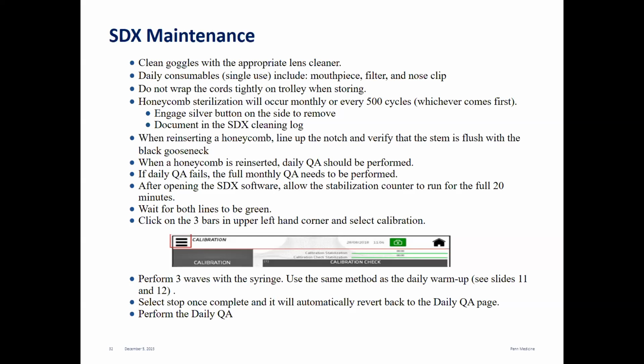So, like I said before, to take out the honeycomb, you need to engage the silver button on the side.